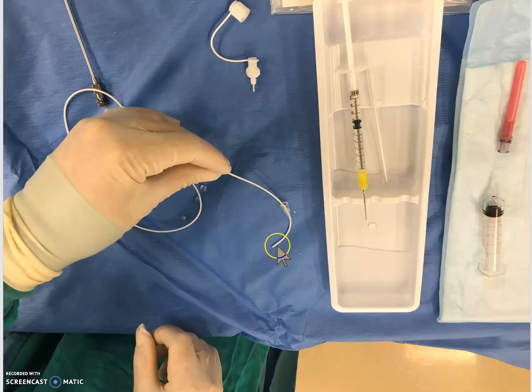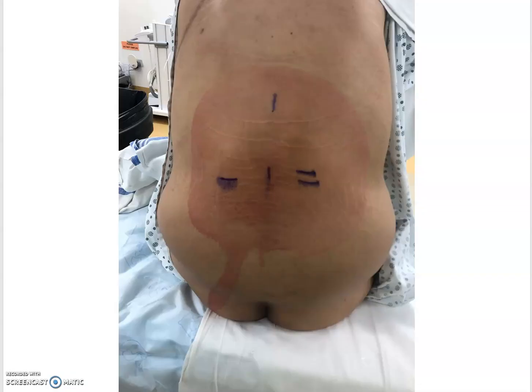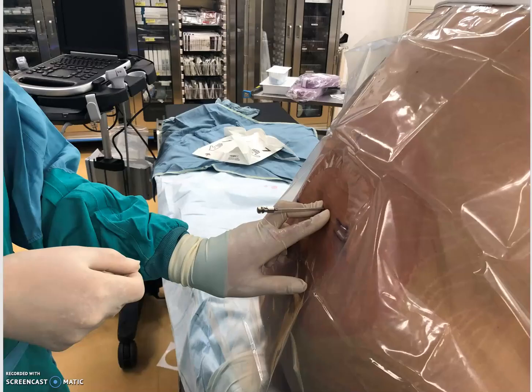Next, thread your catheter through that little pyramid-shaped connector. I usually flush everything in saline to make it a little easier to thread because it is very sticky. Your patient will be set up in a nice curved-back position. I always use ultrasound to confirm the correct level, because we are often in a space higher than we think we are, and for spinal drains it's important to know exactly where you are.